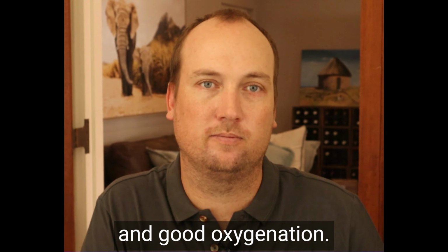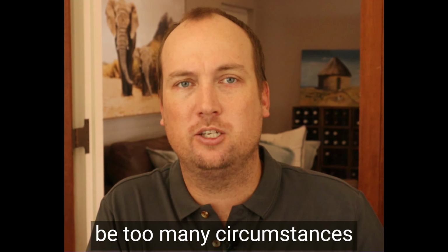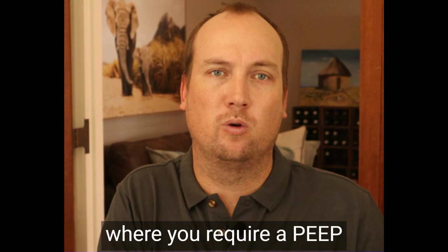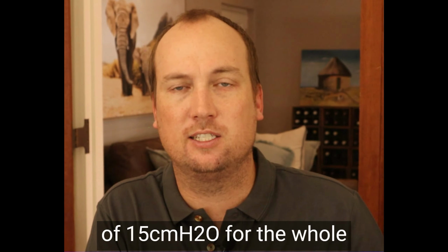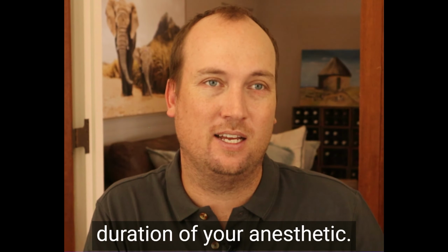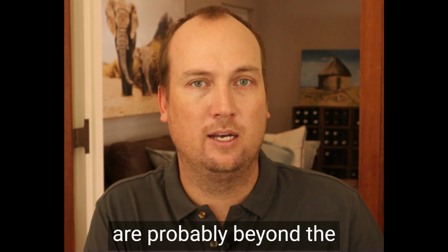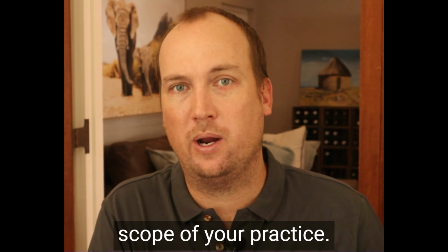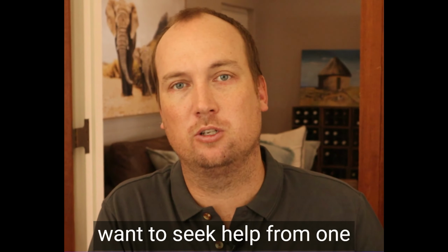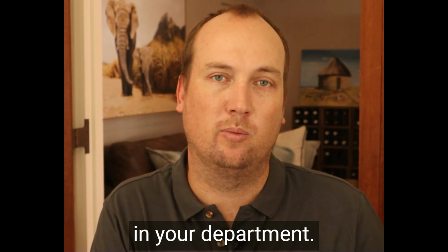I think at a learning anesthetist level, there shouldn't be too many circumstances where you require a PEEP of 15 centimeters of water for the whole duration of your anesthetic. I think that those cases where that's necessary are probably beyond the scope of your practice, and certainly then you would want to seek help from one of the senior anesthetists in your department.